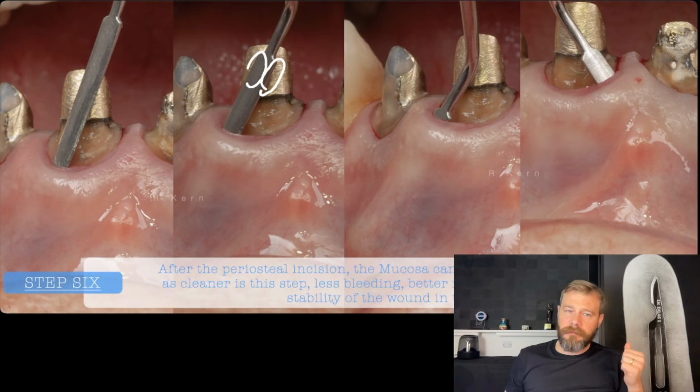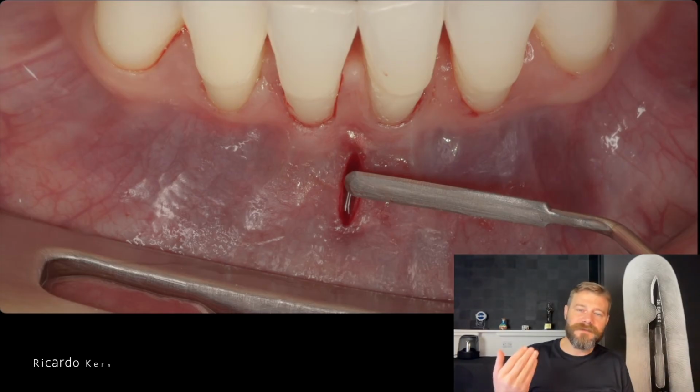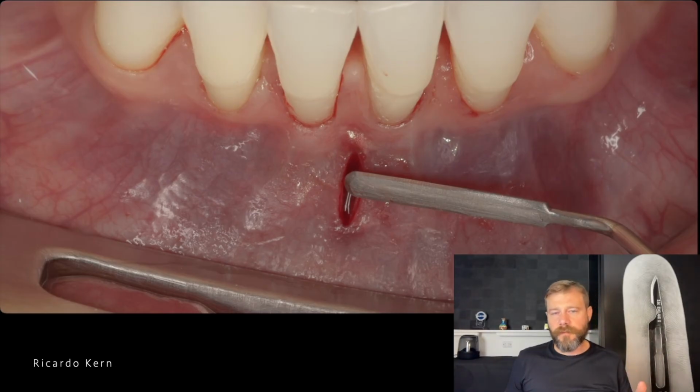Why is that? Because the microblade is super nice, but it's super tiny. When you play a lot with this blade inside the tissue, I may still have some fibers connecting the muscles to the flap on the surface. Or if you like to do a modified VISTA approach, and for me that tunneling is magical. That is one of the tools I need to handle to do some kinds of cases, right?